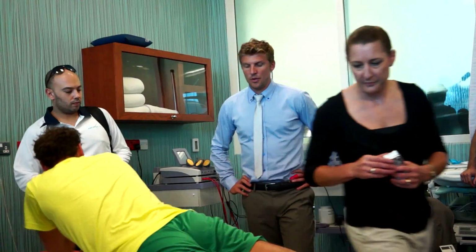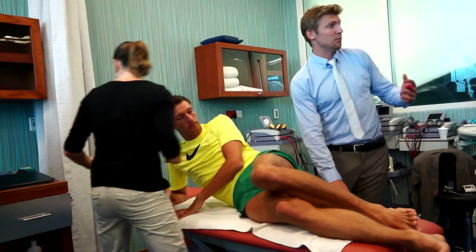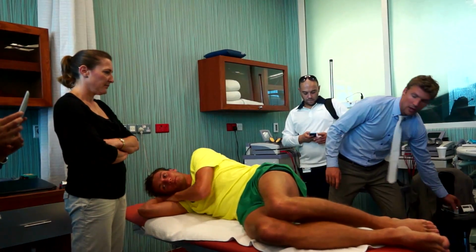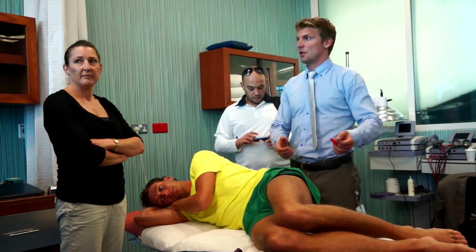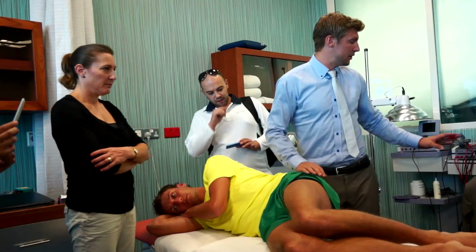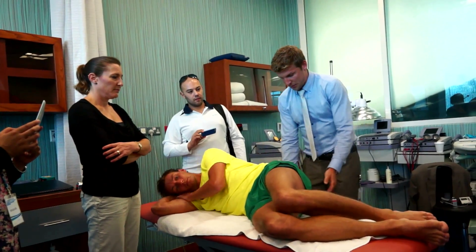Yep. So next up, on the other side. Next up, we're looking to find a measure for the straight abduction movement. A lot of the times when people have described this measure, they're either using a goniometer, and a lot of the times they're using 2 testers, so one holding the goniometer, one reading, and so on. So we wanted to have something that we could use as a single operator, and we wanted to use a digital inclinometer as well, so we're not influenced by that. So if we get Robajan out here to me.